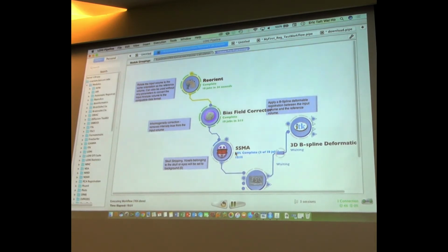Most of the things do require a little bit of work. So right here, the skull stripping takes 20 to 30 minutes. The bias field corrections took 3 minutes. So it adds up. So there is no really. Let me see if any of these might be a little bit faster. Can you do just one image and stuff?